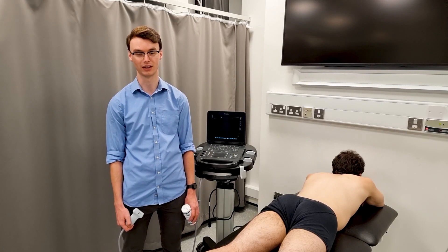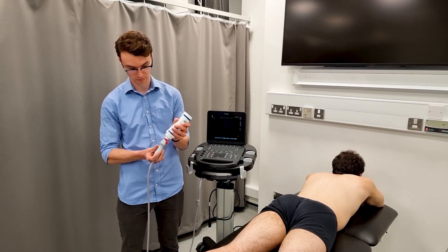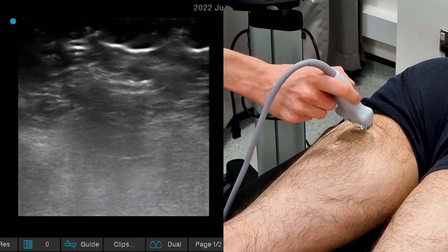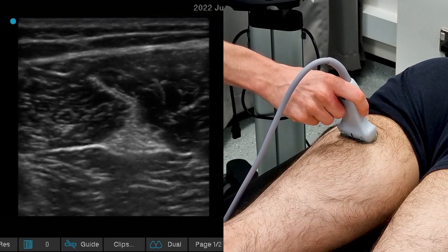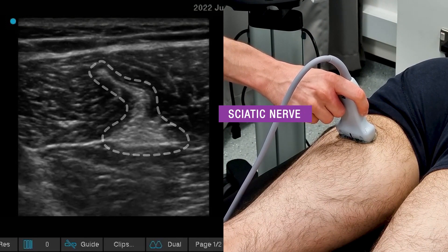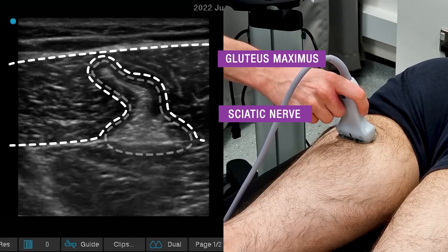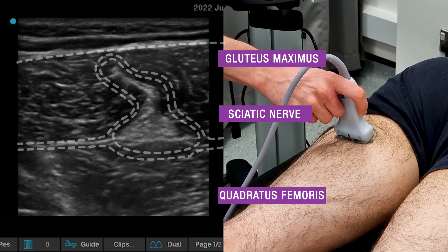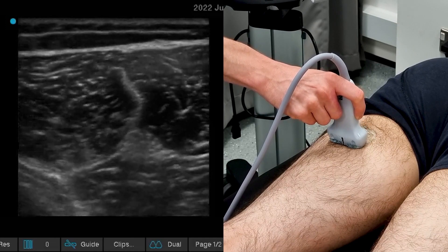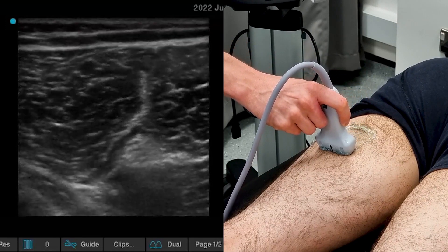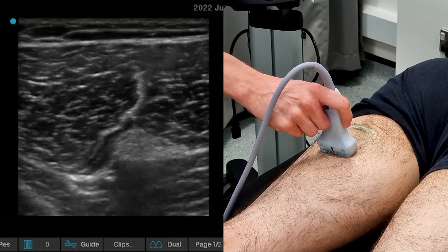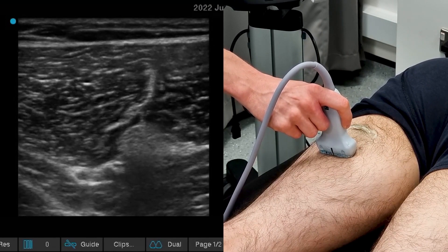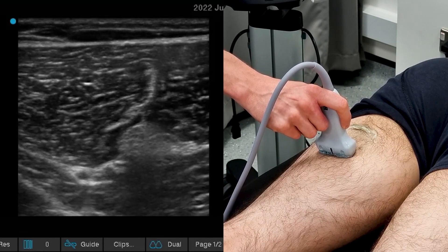Finally we're going to demonstrate the sciatic nerve using ultrasound. The bright white structure we can see in the centre of the screen is the sciatic nerve. Superficial to this is gluteus maximus, and deep to this is quadratus femoris. Now we will follow the sciatic nerve to the mid thigh. As you can see, the sciatic nerve becomes much deeper at this point, making it hard to follow with ultrasound. At some point between the mid thigh and the popliteal fossa it will bifurcate — there is great anatomical variability here.